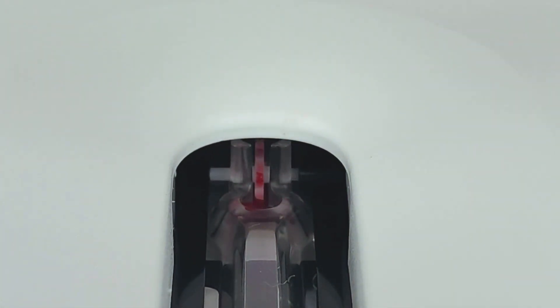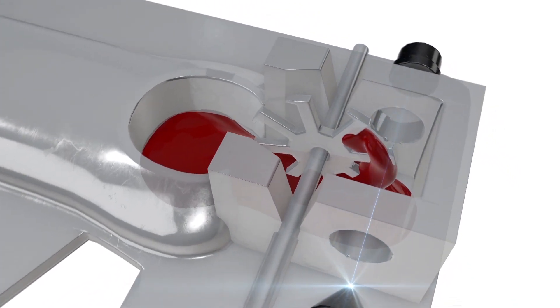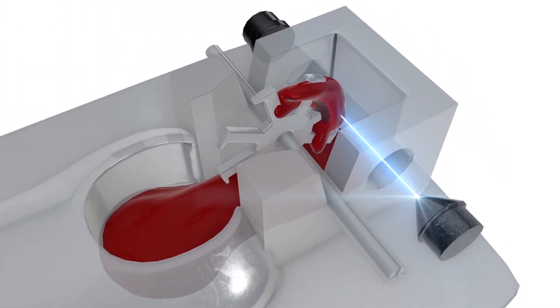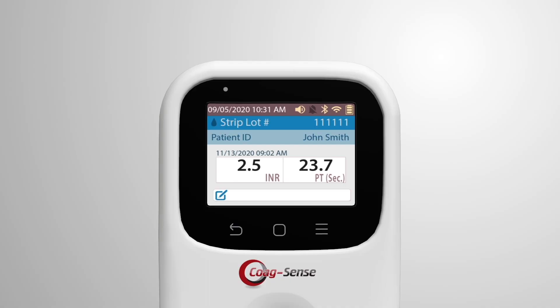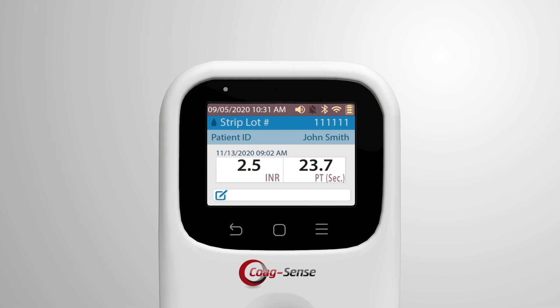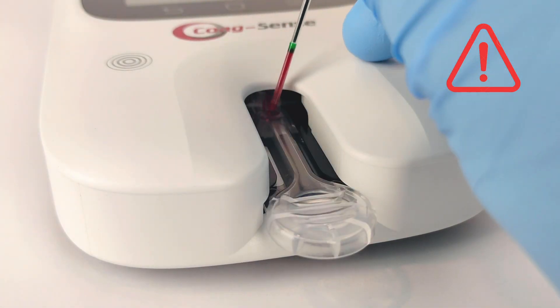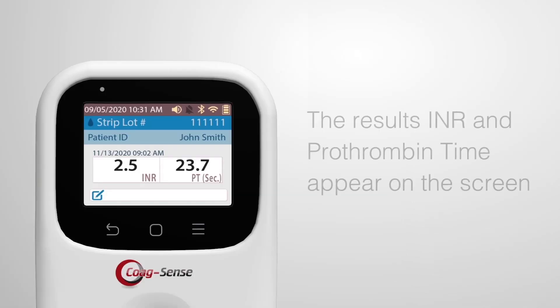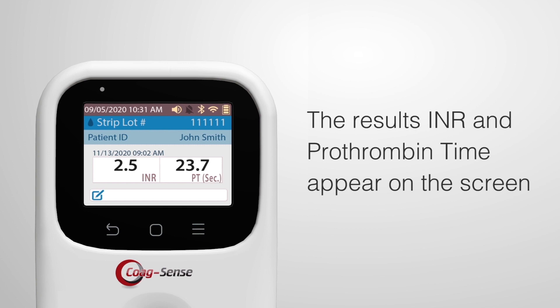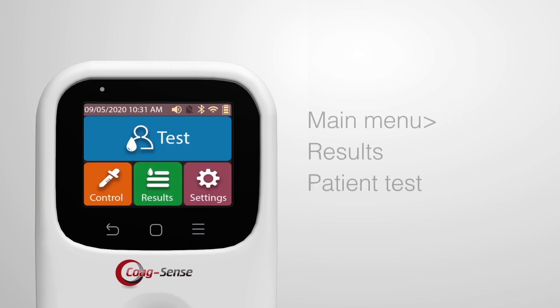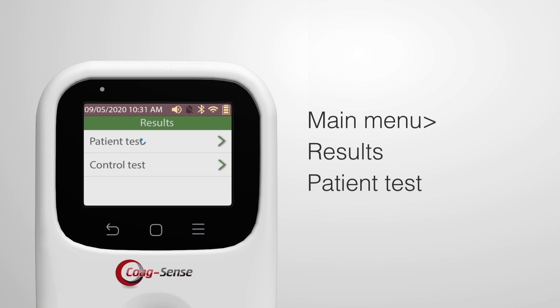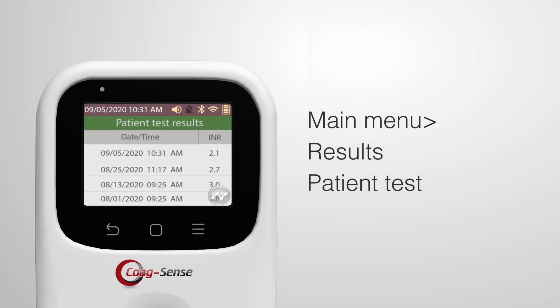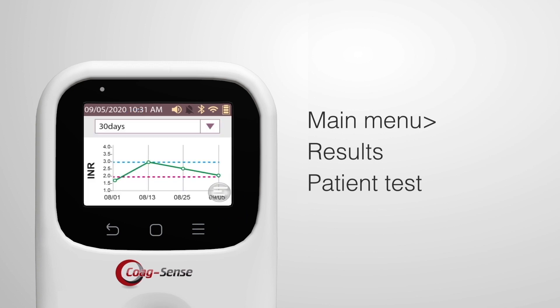The light should go out and the meter should display 'Testing, please wait.' The testing time is the patient's actual clotting time as the system produces a true prothrombin time. Never add more blood to the test strip and never collect a second sample from the same finger stick. When testing is complete, the results appear on the screen. The test result is recorded in memory and can be found on the main menu using Results and then Patient Test.